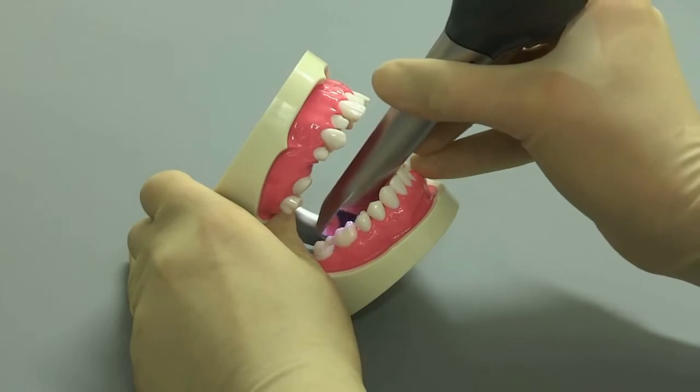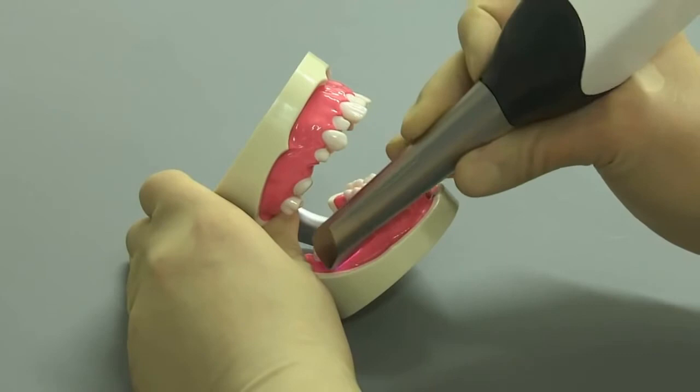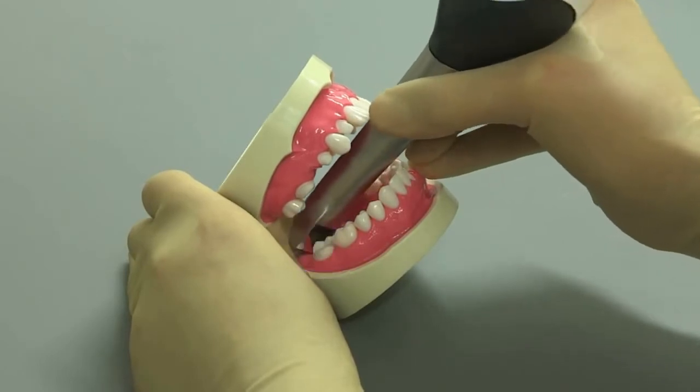of the front teeth. For scanning the premolar and molar regions, now again guide the camera in occlusal, buccal and lingual view.